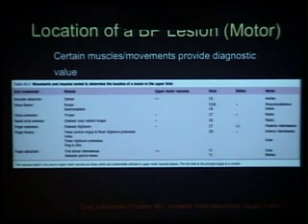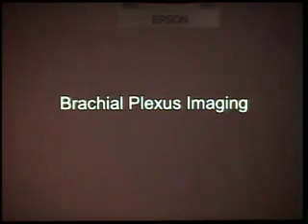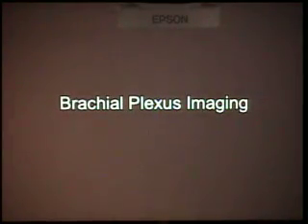This is just one that I kind of keep close at hand. If I'm pulling up a brachial plexus study, I'll just pull this chart out and see, when I call the clinician, ask about some of these, if the patient can do some of these things. For instance, can they abduct the shoulder, can they flex and extend the elbow, and it may help you localize kind of where to look.